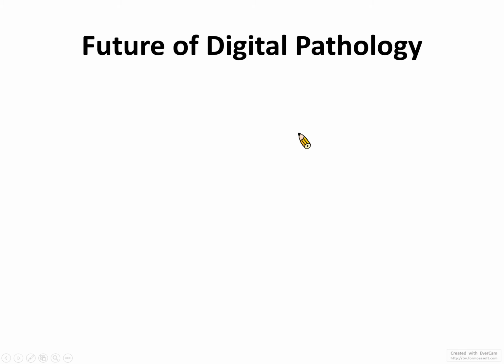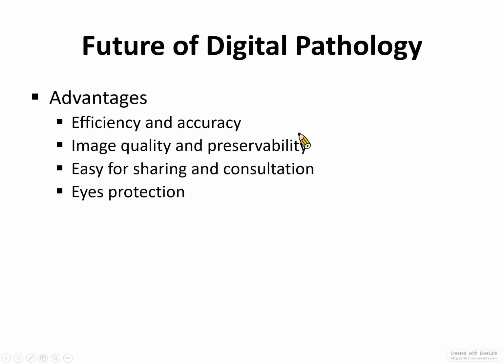But if you are using computers, it could probably be safer and help prevent your eyes from having some retinal disease. Okay, so for the future of digital pathology, I think the advantages are efficiency and accuracy, we can preserve the image quality, and it is easy for sharing and consultations, and eye protection.